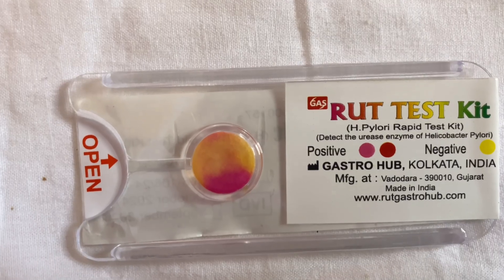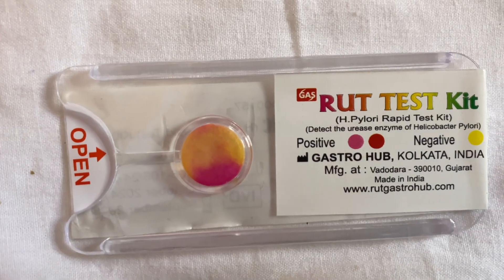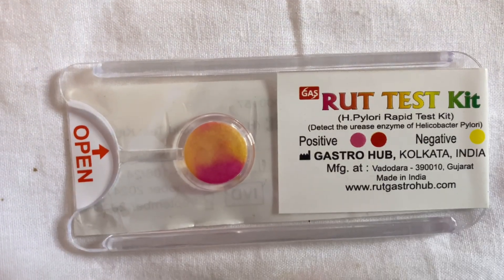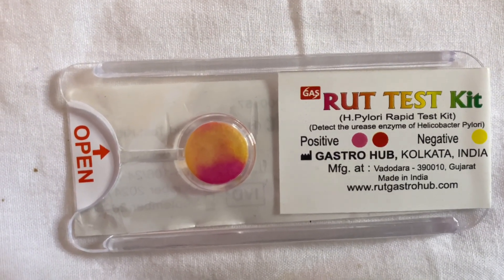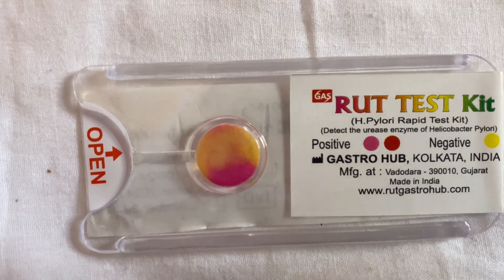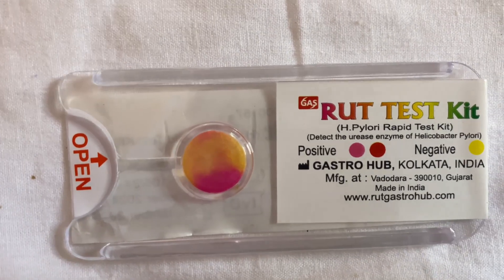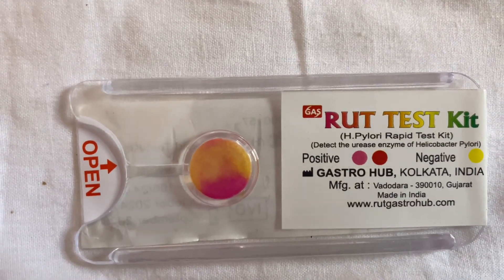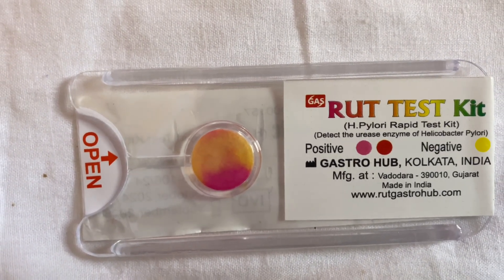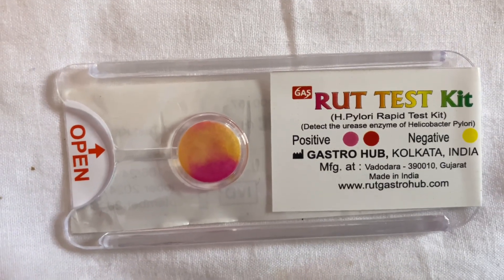There are different factors which influence the RUT test result. The first is the bacterial load. If the bacterial load is high and the infection is severe, we get a very good change in color within the first 10 minutes. A lower bacterial load can lead to a false negative, or a slower change in color — which is why they ask to observe for 3 hours, so that even a small change in color can be considered as indicating the presence of H. pylori.